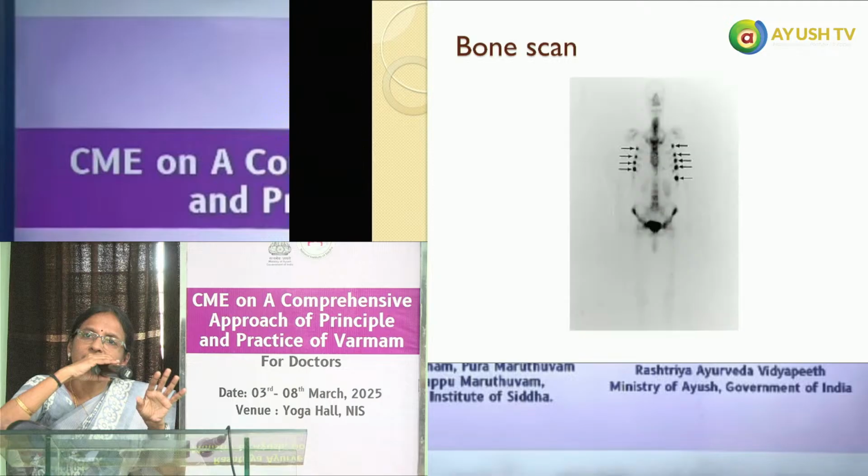So now extra அந்த ribcage இருக்கிற இடத்துல dots ஜாஸ்தி uptake இருக்கு. This means there is already a history of injury in the rib. So the fracturesல இந்த radioactive tracer material நம்ம கொடுத்தது போய் ஜாஸ்தியா it has been taken up in those spots. This is how they will interpret.